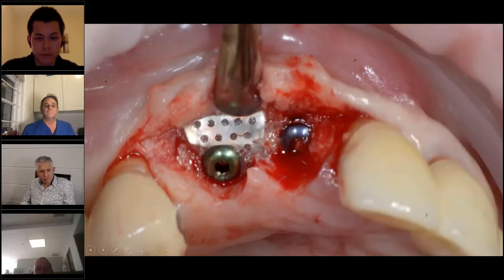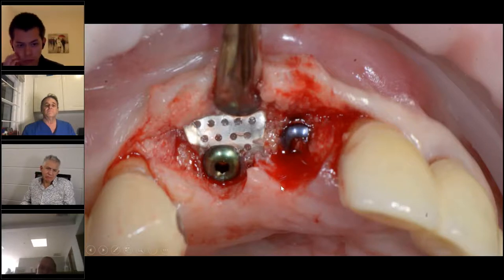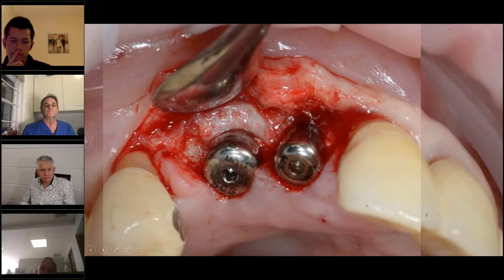And now we'll just let it heal a little bit. And you can actually see when we go inside here, you can see the titanium mesh here, and this is without the mesh. Sometimes the EthOss and the new bone sticks into the soft tissue. It actually grows together. So when you open the flap, you have to be a little bit careful because sometimes it sucks into the soft tissue and you lift it up from the implant. But in this area where we have the titanium mesh, we don't need to open up a big flap. We only unscrew it and push it out. And actually, this is the bone, and these are the healing abutments in place. And you can see the massive gain of newly formed bone here.